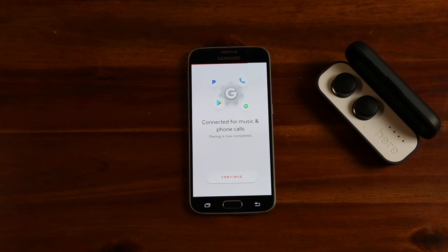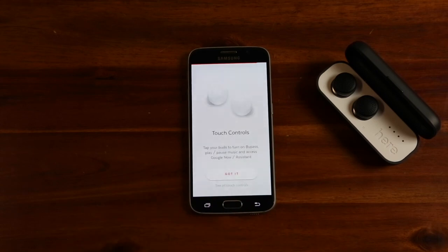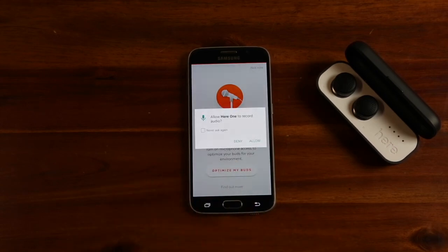You should see a confirmation screen that pairing was successful. If you do not see this screen, follow the instructions within the app. We will skip the listening profile in this video, but we recommend you complete it now. Once listening profile is complete, you will be ready to listen to music, take calls, and control real-world sound with HearOne.